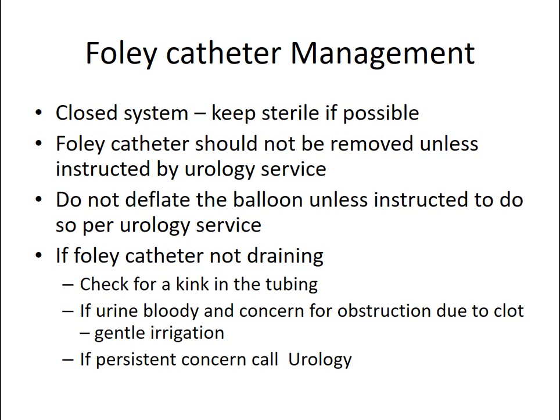Do not deflate the balloon unless instructed to do so. Again, good intentions, maybe the catheter is pulled down, I'll just deflate the balloon and push it back in. The risk is child moves, catheter falls on floor, and no longer do we have a catheter in place. So please make sure that the service is aware prior to affecting the balloon.